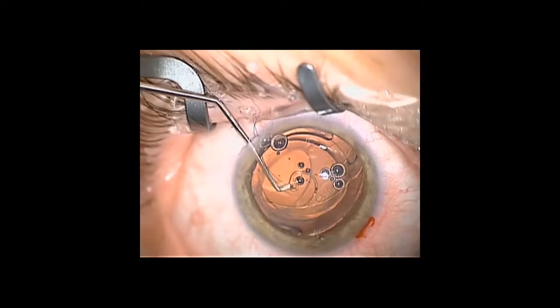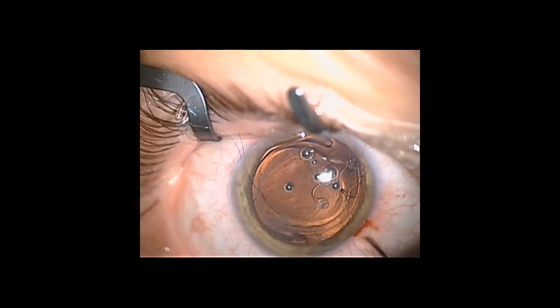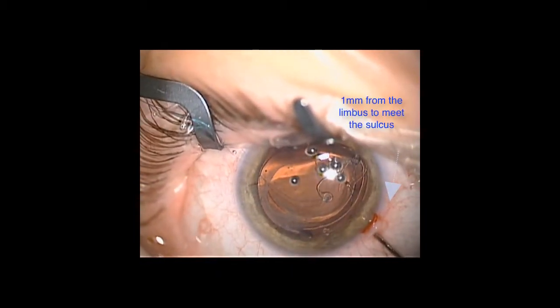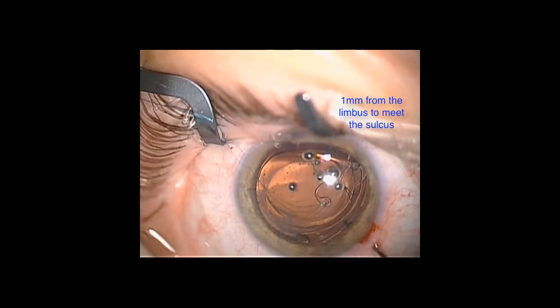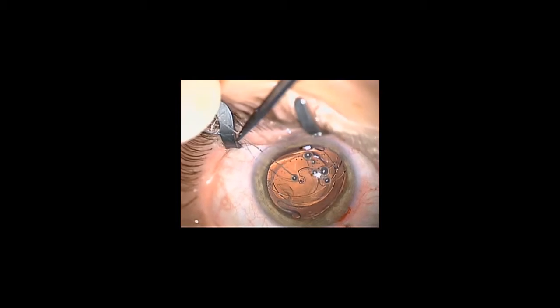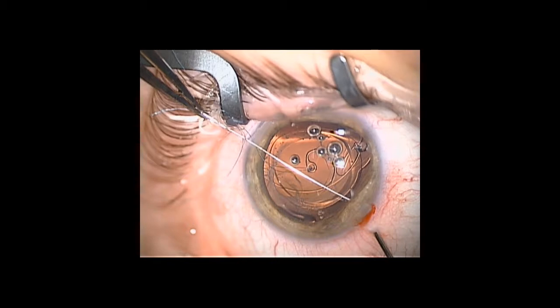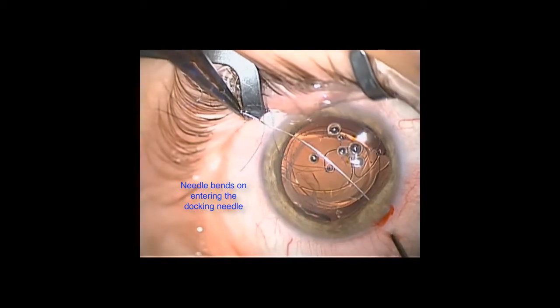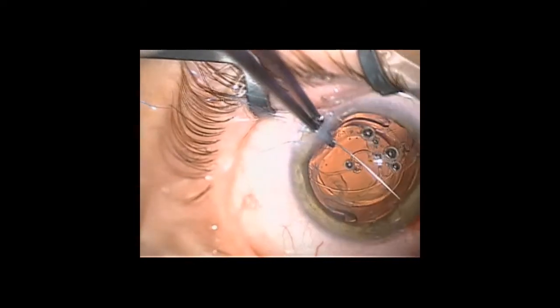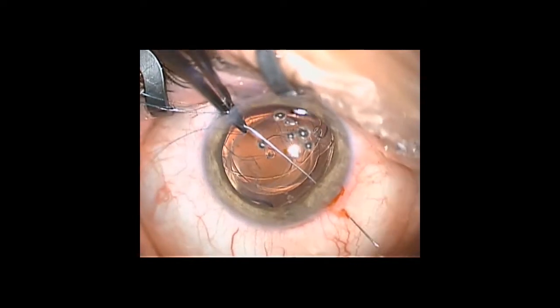A docking needle then pierces the conjunctiva and sclera one millimetre behind the limbus, through the prepared scleral pocket into the eye at the position of the sulcus. This acts as a guide for the needle holding the 10-0 prolene attached to the ring segment. The needle is then gently guided through the sclera, taking care not to damage any other structure either at the front or by the trailing end. A curved needle — for example the KIF-4 needle — would make this procedure slightly easier.